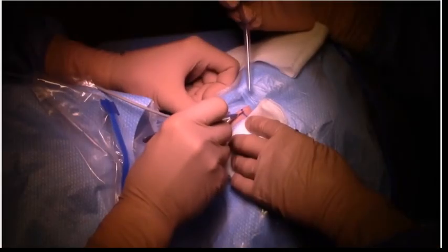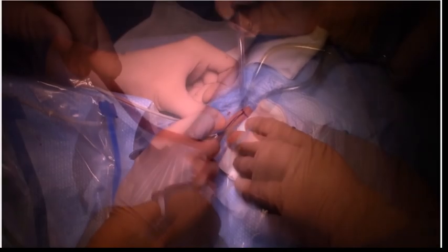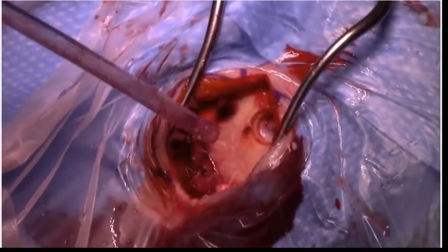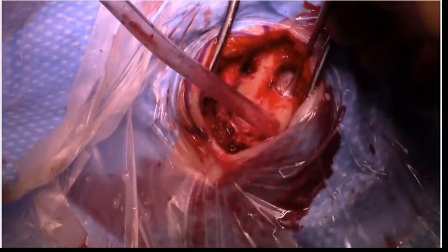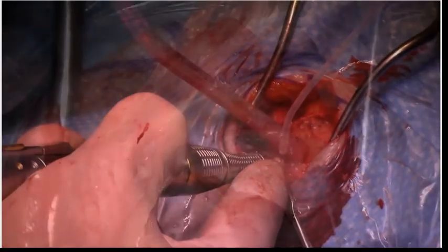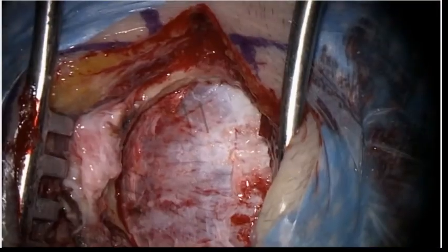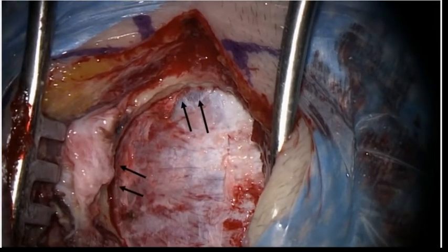The skin is incised in a straight fashion beginning over the sinus knee. The burr hole is placed below the asterion, 1 cm over the mastoid incisura. After removal of the bone flap, the sigmoid sinus margin is exposed with a high-speed drill. In doubt, a Valsalva maneuver can help identifying the sinus.